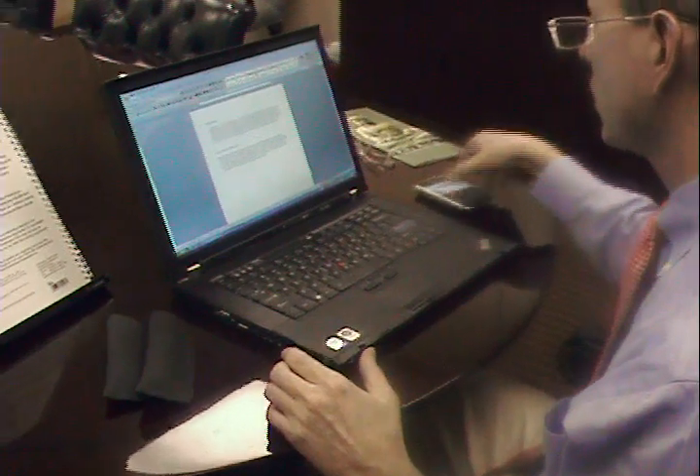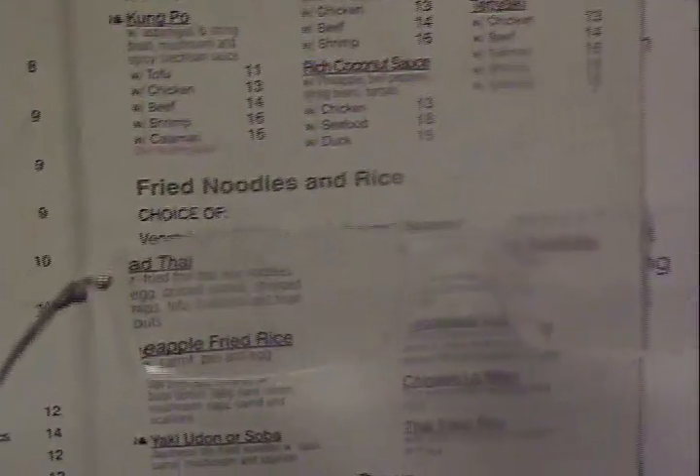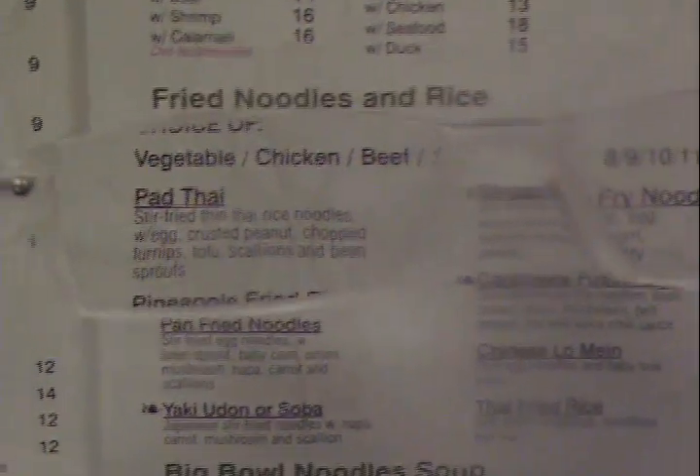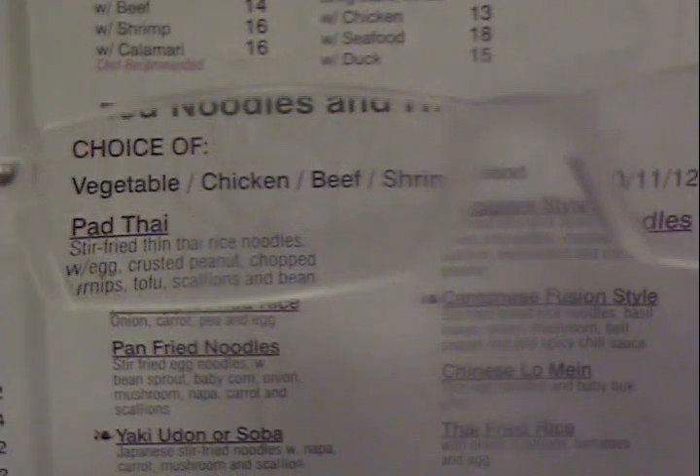Another application for the MiniFrame II progressive readers is reading a menu. We actually have a menu here. Taking a look through the MiniFrame IIs, you can see we get a nice crisp image, edge-to-edge clarity, looking through the lens of the progressive reader.